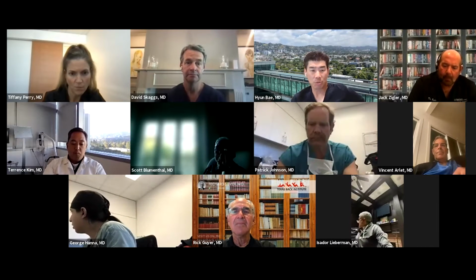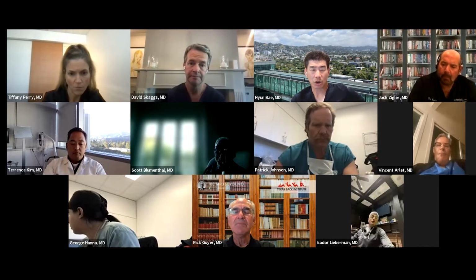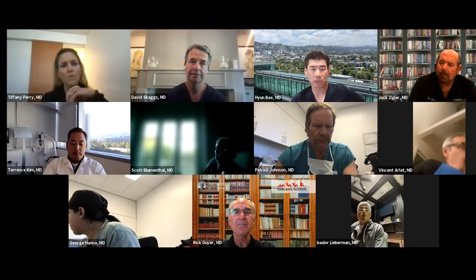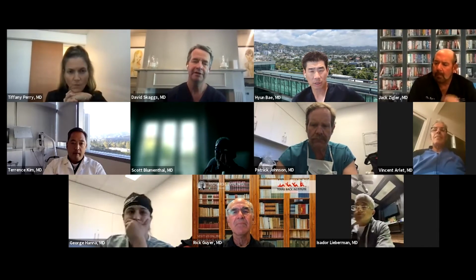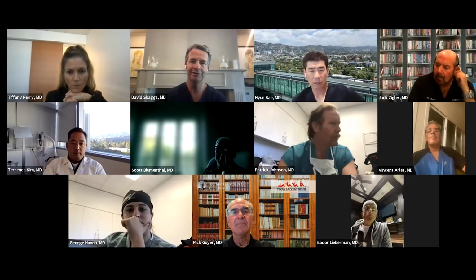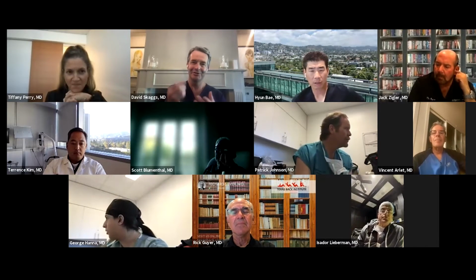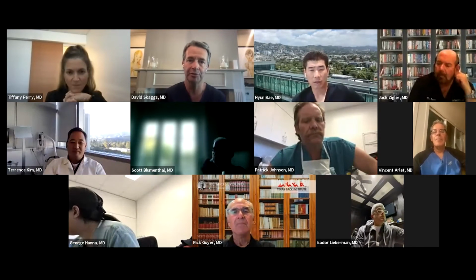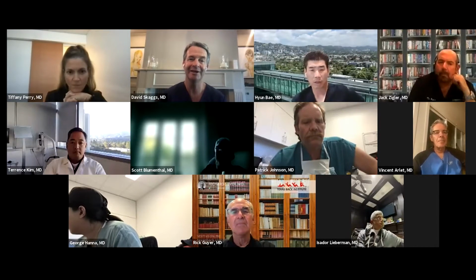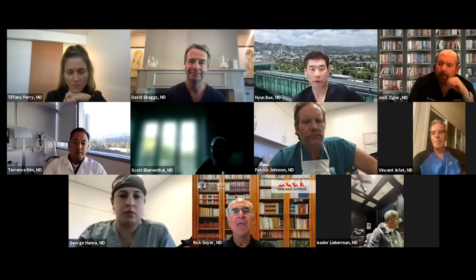I just want to ask you, I've got to adopt this. When you start, do you use a burr to get the starting point, or do you just use the drill to get the starting point? Do you burr it like a little starting point first? Yeah, you know what? You just pointed out a big hole in my talk. Thank you. Yes, of course we use a burr, and we do go right through the cortex, and it's kind of nice to see that cortical blush. And I have to put that into the talk. Absolutely. Thank you.